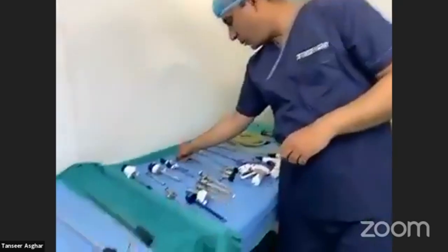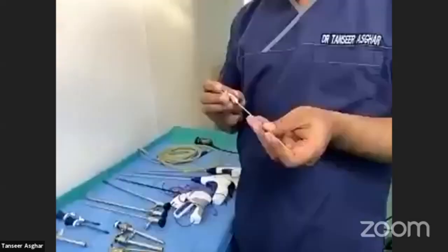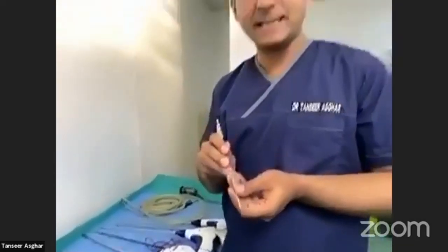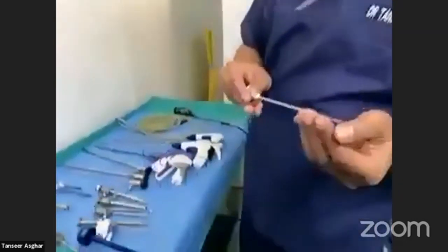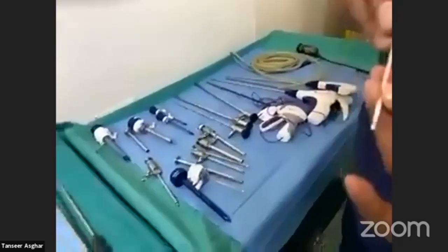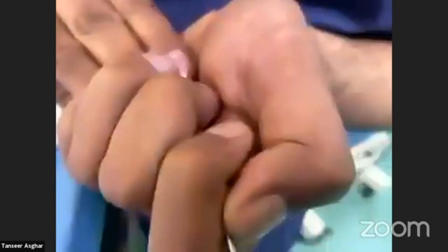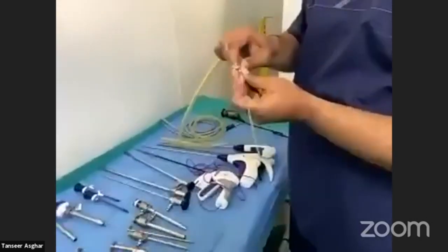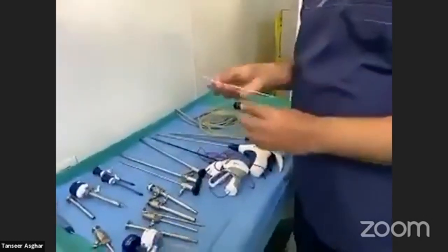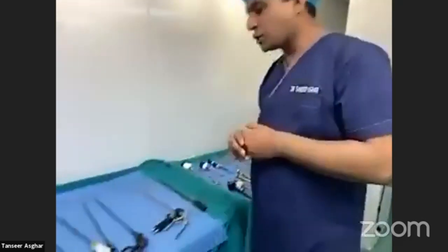There are a few more instruments related to this. This is the Veress needle — a special needle that gives you access to the abdominal cavity. It has a blunt end; when you go in, it automatically retracts and the sharp end penetrates. Once inside, you attach the gas pipe over it. This is an important instrument for establishing pneumoperitoneum.